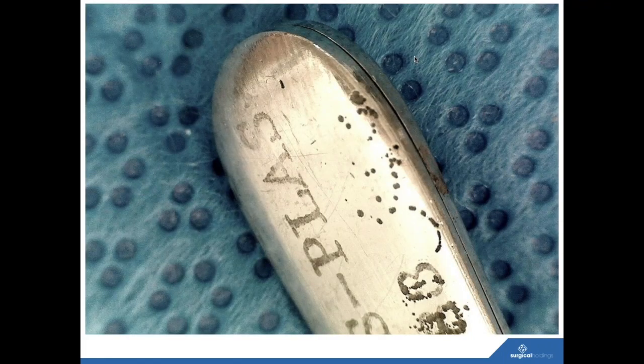Another pitting visual, which clearly shows this is a widespread issue, and perhaps the passive layer has broken down and there's a real consistent attack going on across the device. This is one of your images, Bob. Was there a story behind this one, or is this just one from your catalogue? Yeah, just one that I find when I'm out on the road.